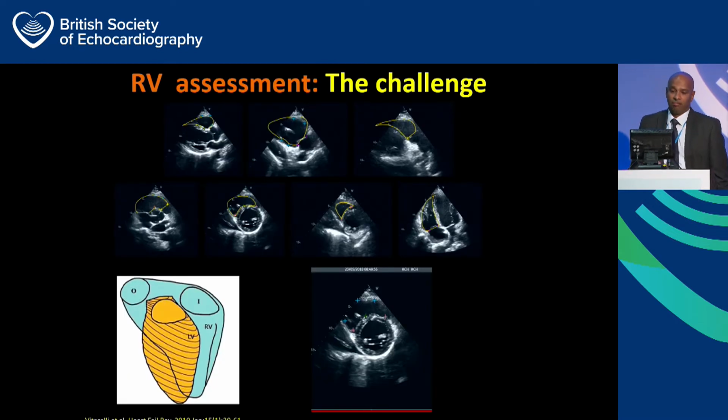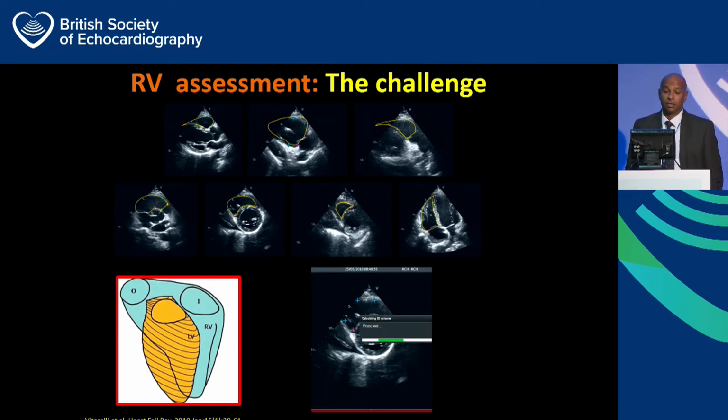The right ventricle has a very complex geometry, and that's highlighted well in this slide. I'm not sure if the IT guys can click on the video on the bottom right. Do you mind clicking on the video? It should play. There we go. So it has a complex structure.